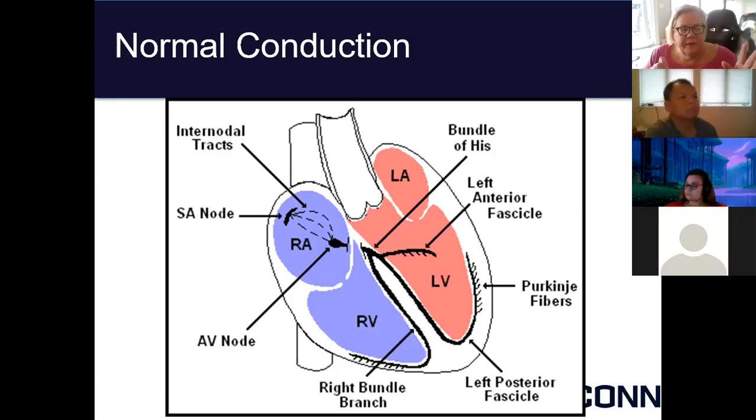You'll still have a P wave in most cases, but you've got this wide complex, which indicates slower conduction, because the EKG is all about time and electrical conduction. That's called a bundle branch block. You just have to figure out, based on what lead it's in, whether it's a right bundle or a left bundle.